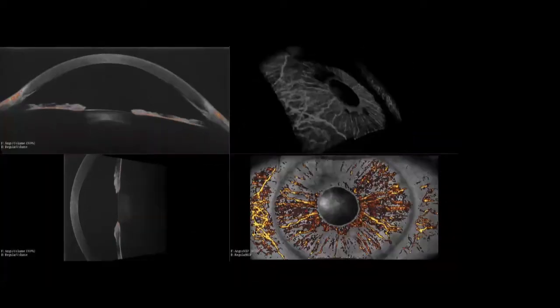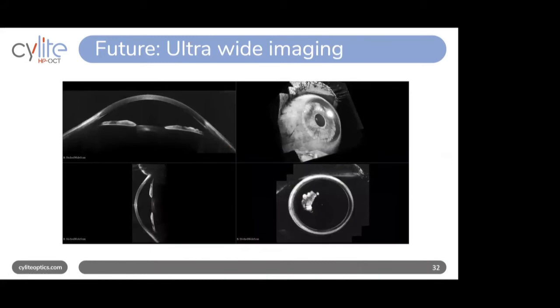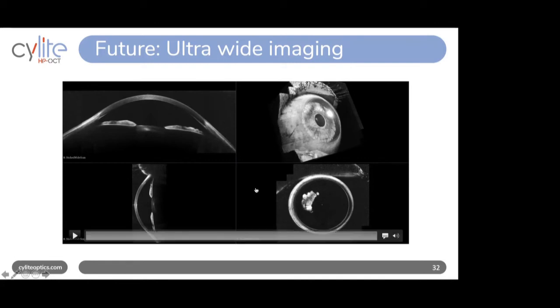And then finally, this is some very latest stuff we just published this week, which is looking at ultra-wide imaging. For many myopia applications, you use a thing called a scleral lens, which you put over the eye. It's a hard lens, and what it does is it bends the eye back into shape whilst it's on top of the eye. But you need to be able to fit it very well. There's also a company called Mojo in the US who are developing a contact lens version of a Google Glass, which has to fit very well onto the eye. This would be a great technology for those sort of guys to be able to see how well their thing is fitting.